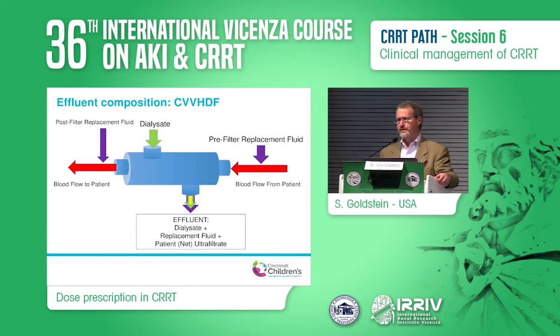Now, why would you use different modalities? In convective clearance, larger molecules are removed more efficiently than with dialysis. In solely a diffusive mode, the clearance is based on the Brownian motion of the molecule, with larger molecules moving slower, so the chance of them moving through the semipermeable membrane is lower, whereas in continuous veno-venous hemofiltration, fluid is pushed through and solute drag will drag those larger molecules at a more efficient rate than just continuous veno-venous hemodialysis. Again, with small solute clearance, the clearances are generally the same across all three of the CRRT modalities that use some form of replacement fluid or dialysis fluid.